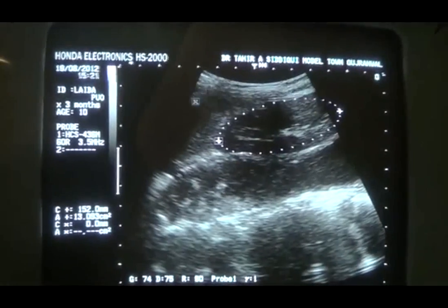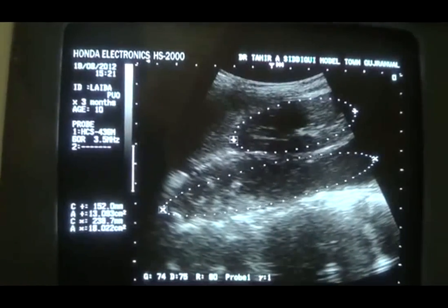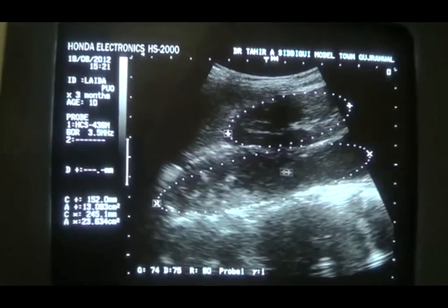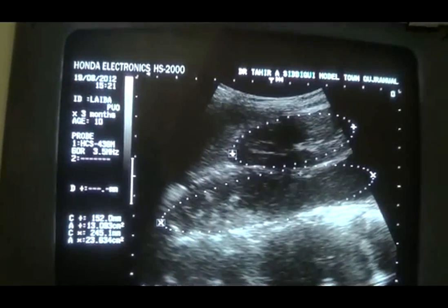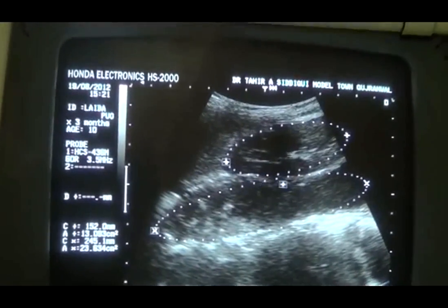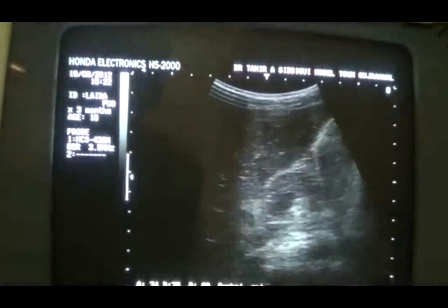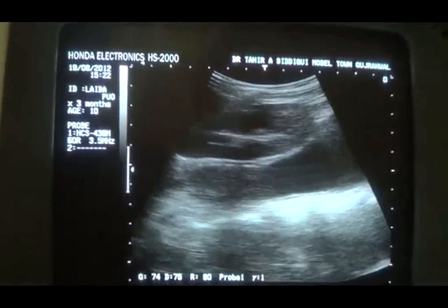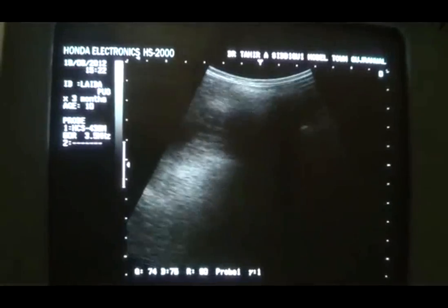This is the spleen. This is the splenic tissue. Now this tubular structure, this area, having echoes here, these are sand-like particles within it, and these are non-shadowing echogenicities, seen more prominently at the edges of the anterior and posterior wall of this longitudinal cystic area that extends from the posterior medial aspect of the left kidney down up to the left adnexa, left pelvic region.